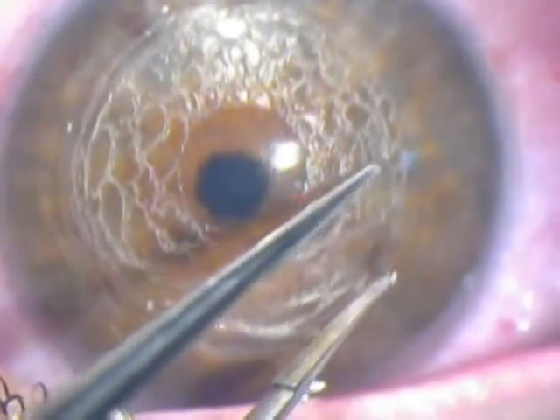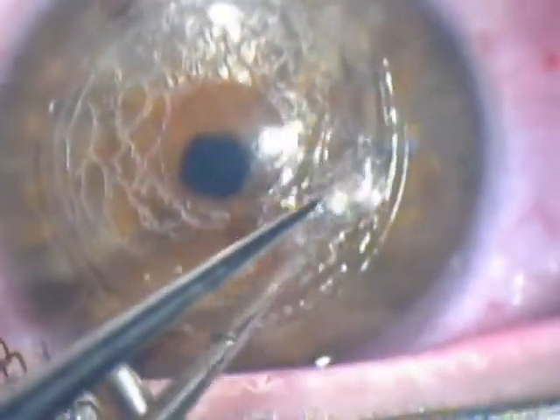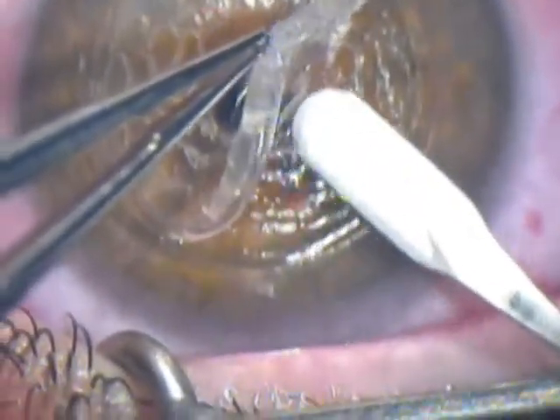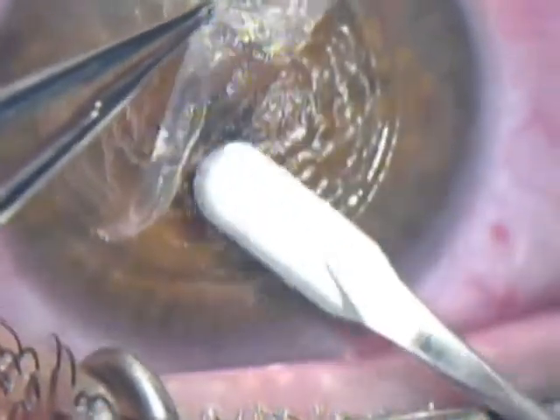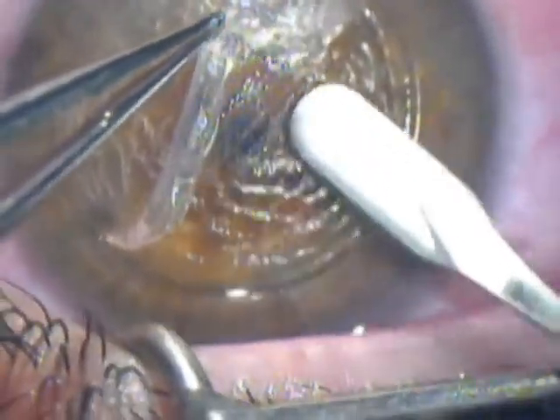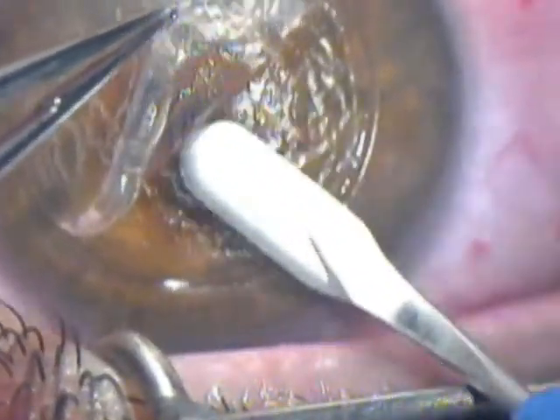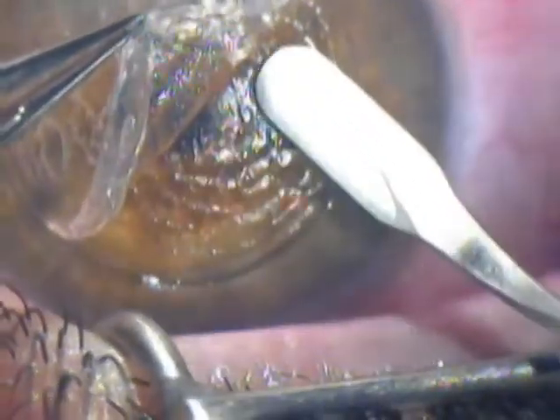We then lift from the cut edge of the disc and manually dissect in the area that was not cut by the femtosecond laser, the 3 millimeter central visual axis area. With this, we seek to create a much smoother and more regular interface, enabling a correct post-operative visual acuity for the patient.